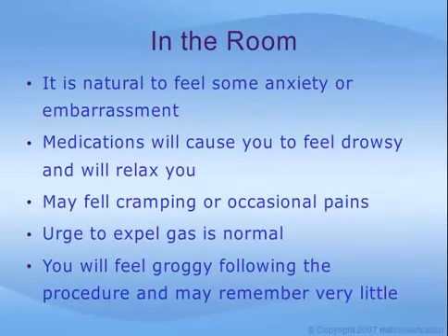This test can be embarrassing and uncomfortable for some people, and this is natural. During the test, you may feel very drowsy and relaxed from the sedative and pain medications. You may experience cramping or feel brief, sharp pains when the colonoscope is advanced or air is blown into your colon. As the scope is moved up the colon, you may feel the urge to have a bowel movement and expel gas. If you are experiencing any pain during the procedure, tell your doctor.